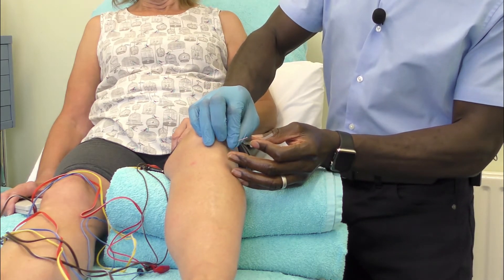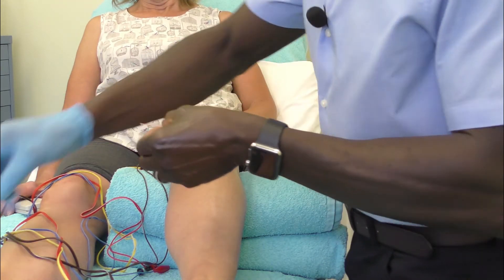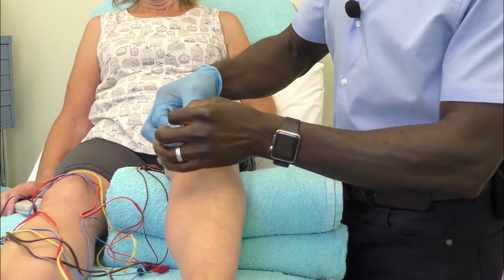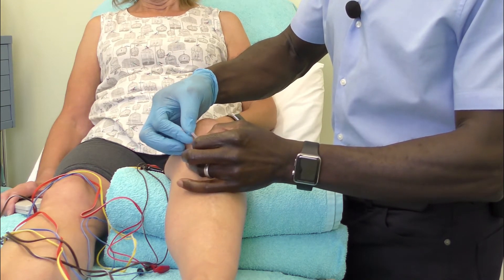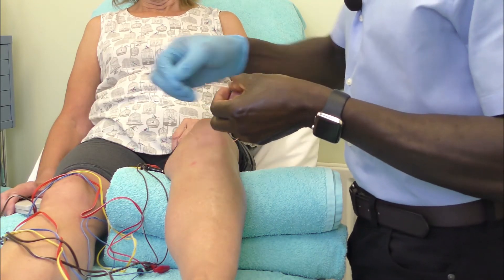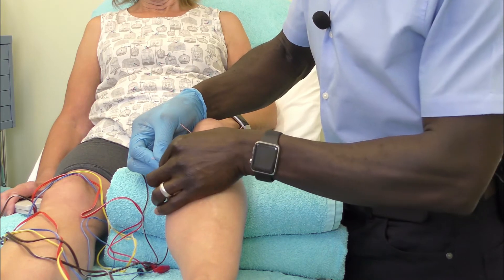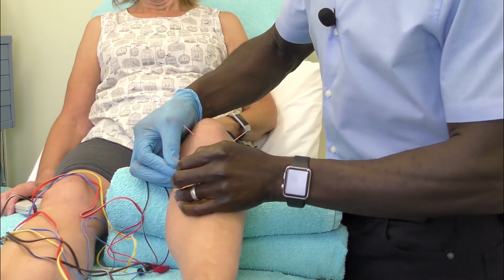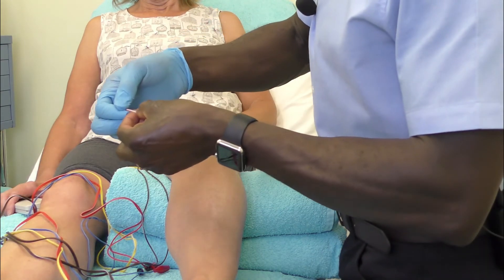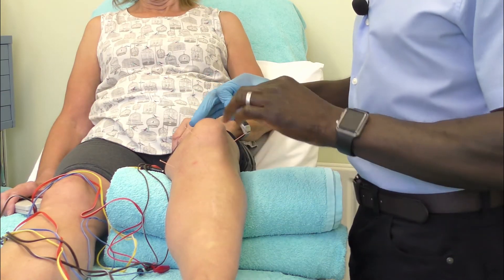So we shall start with this one. That's the extra point. You can then go on to utilizing Spleen 9. If you think about Spleen 9 and Spleen 10 segmentally, these two points cover all the segments for the actual knee with regards to pain management, so if you're going to use any points on a segmental basis it'll be Spleen 9 and Spleen 10.